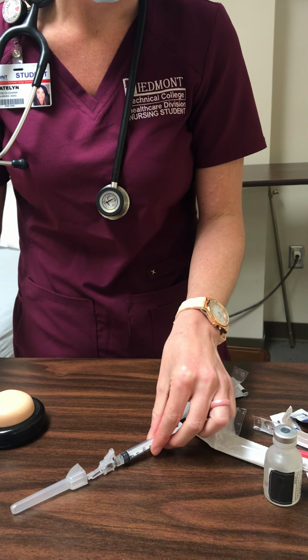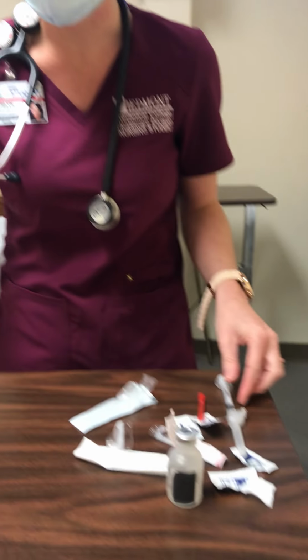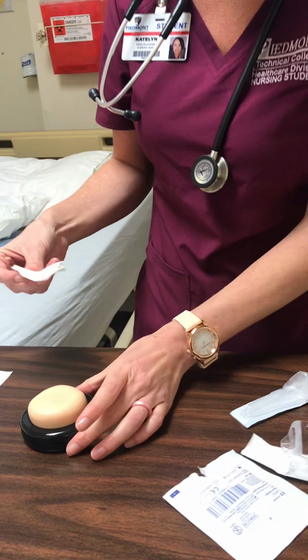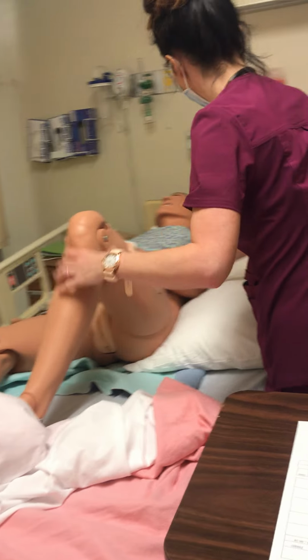Now I'm going to activate the safety mechanism on my needle, and I would dispose of this in the appropriate sharps container. I'm going to get my gauze and I would apply gentle pressure here on the injection site. Okay, now I'm going to move my patient back into normal position.